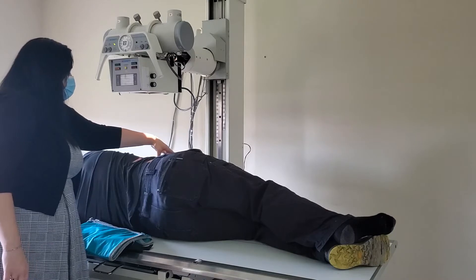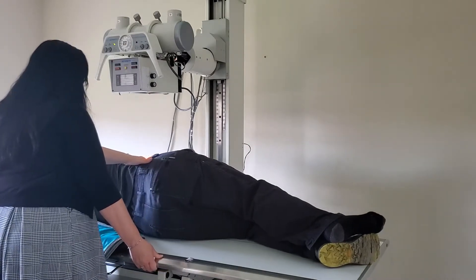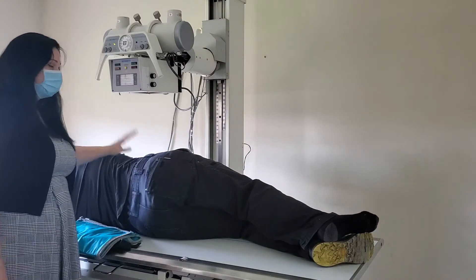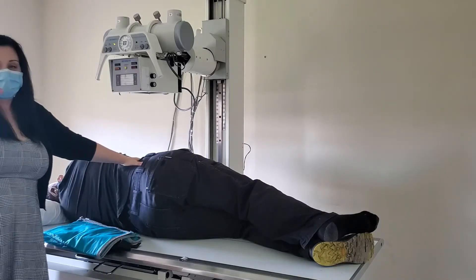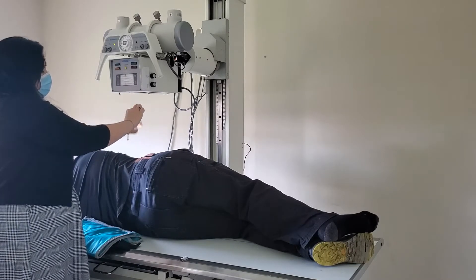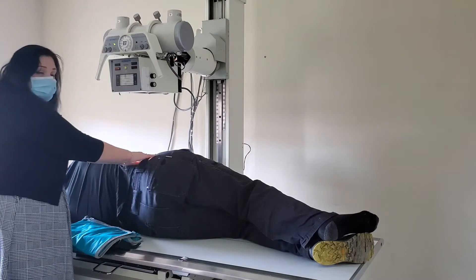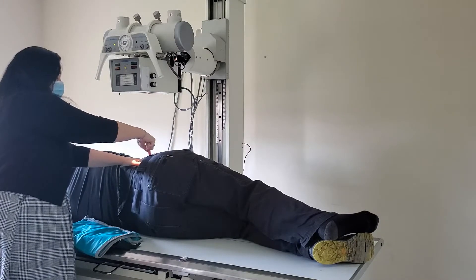So two inches back from the elevated ASIS and an inch and a half below the iliac crest. You can use the three-finger method, but here's a better trick: make an L with your hand — or a backwards L with your right hand if working the other side. Place it so your thumb is at the base of the iliac crest and your first or second digit is at the top of the iliac crest, forming a full 90-degree L. Where your first knuckle (MCP) and the tip of your thumb meet — where that square forms — is typically where your centering point will be. If you center to that spot, you're going to get your spot shot. That's where I centered for my two inches back and inch and a half below, with the central ray directed exactly at that meeting point.